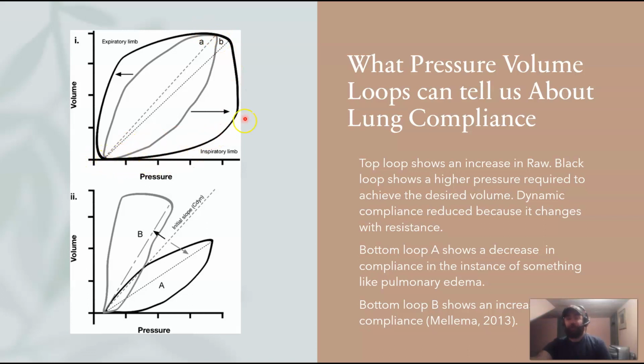You can see how far that pressure curve is going out here. Okay, and it's a constant level of pressure going up. Okay, so then back to your expiratory, and then you're going to see a small decrease here in your dynamic compliance because it's reduced with the increase in resistance.